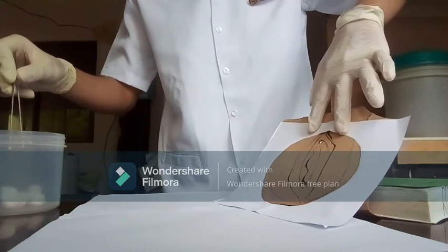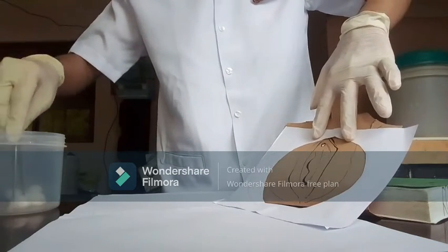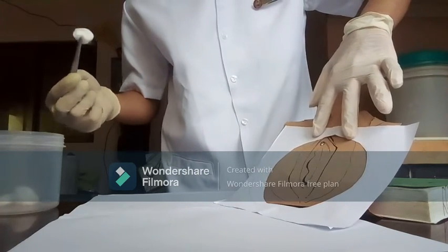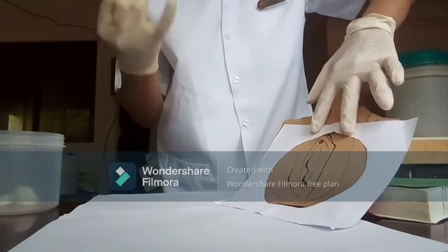So firmly spread the labia with the non-dominant hand. The technique to cleanse the meatus is from farthest to nearest, in an antero-posterior direction, from top to bottom, then wipe.